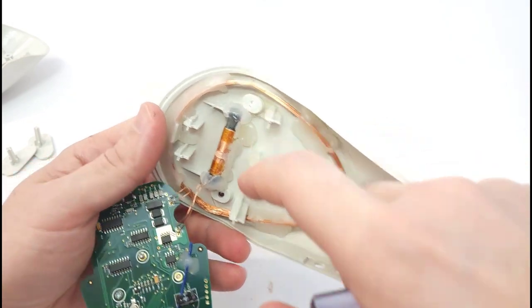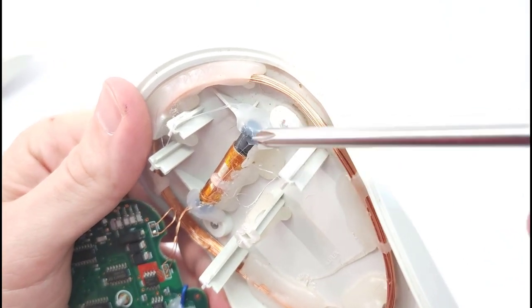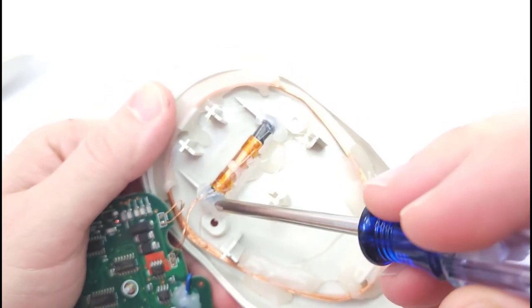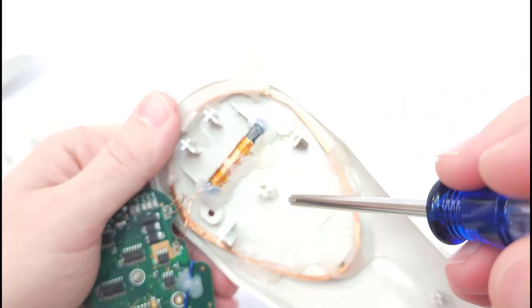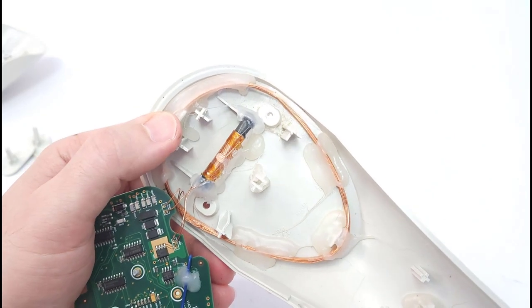It's this one because, again, if I try to get this a little closer, I have slathered a lot more glue on here than was there initially. Initially, there was just kind of a little dab on each end, and that's what was coming loose, and this thing was just dangling around down here in the case, so that was the rattling noise you would hear when you picked it up, and that's why it wasn't working.